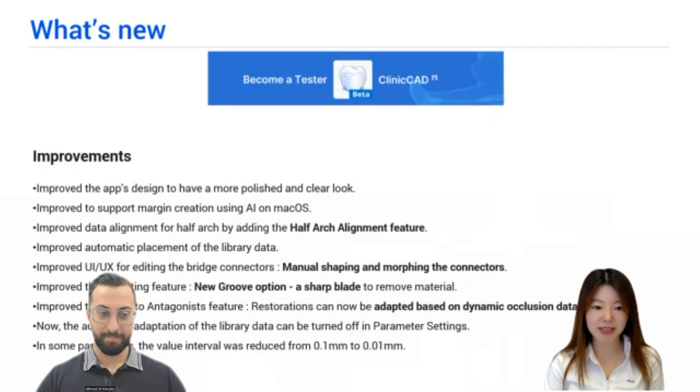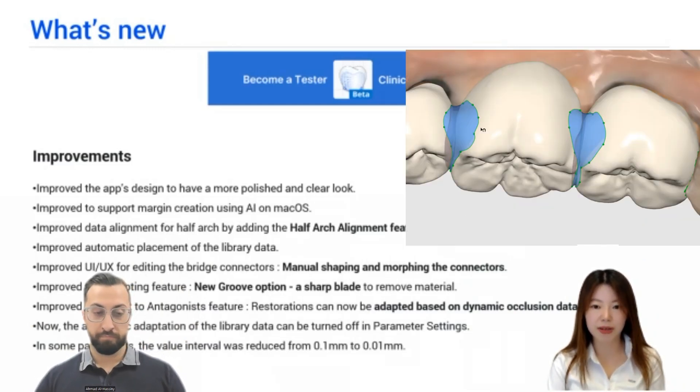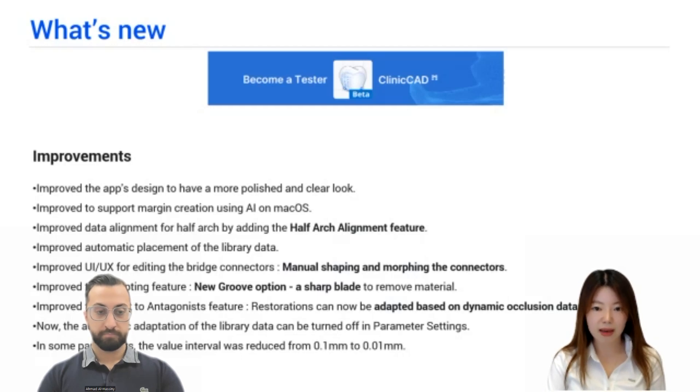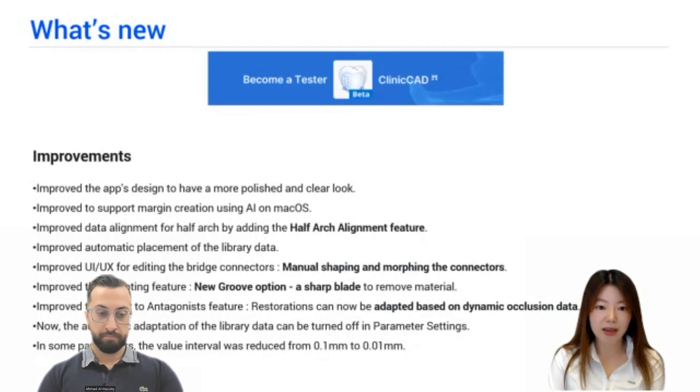There are many improvements here. Half arch alignment is now available — you can set the connectors manually by moving some points. A sharp wax knife has been added, so you can create not only the main groove but also secondary grooves. And the last feature is amazing: the Medit Scanner can acquire dynamic occlusion data, and now it can be adapted to crowns — all eccentric movements of the mandibular jaw can be applied to the crown, so interference areas can be deleted at the design stage. This is a free app, so please try it and give us feedback.